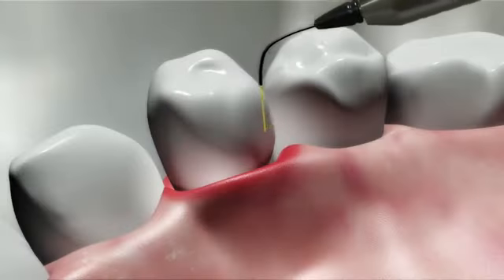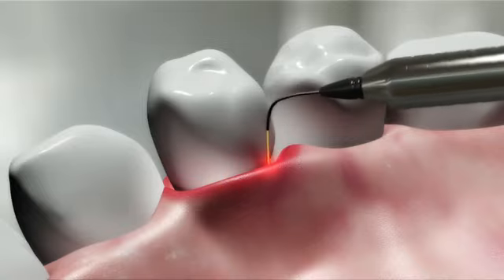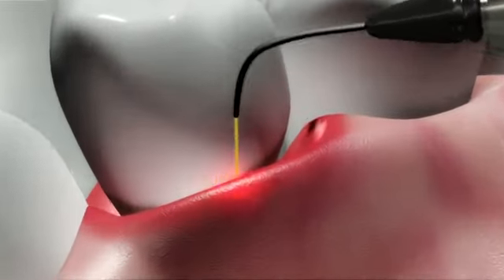After completing a gross debridement of the treatment area, the ND YAG laser is used to remove the diseased epithelial lining to within 1 mm of the bottom of the pocket.